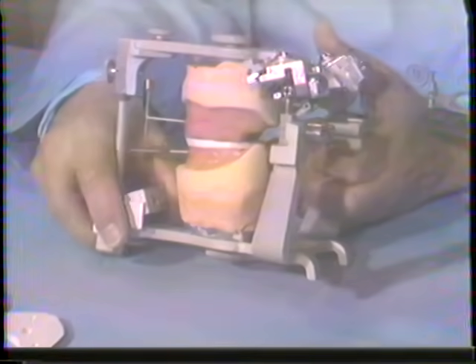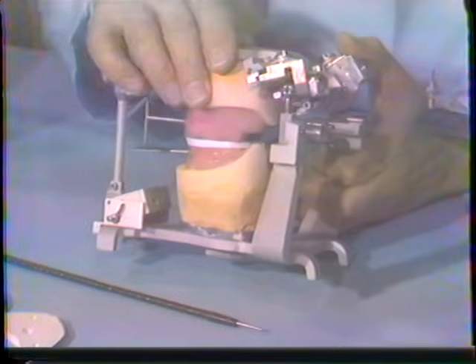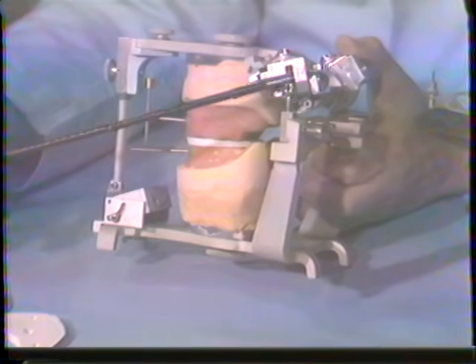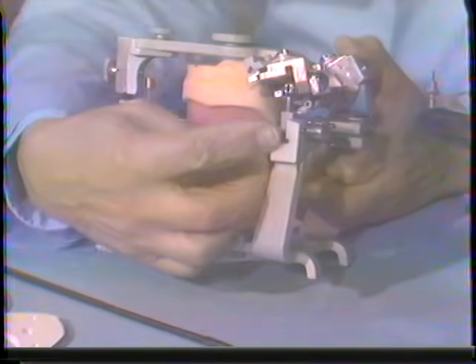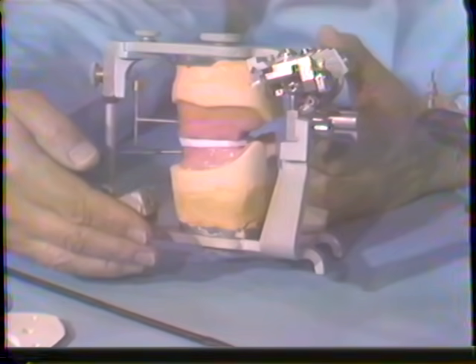The last one that we had just discussed here is an arcon instrument, which means that the path that the condylar element down here traverses is attached to the upper member of the instrument. In other words, the guiding path is on the upper member, and the element, also called axial centers, is attached to the lower member of the instrument.